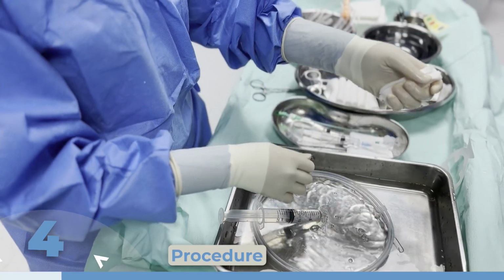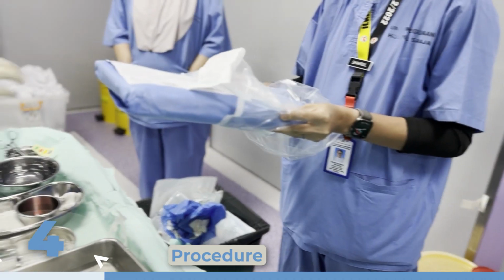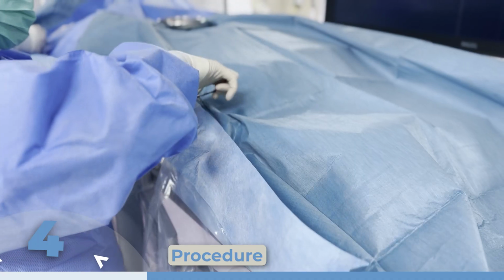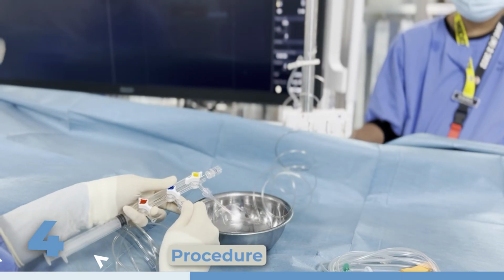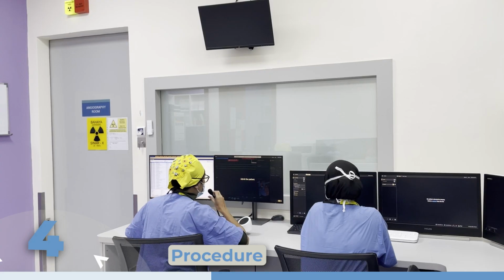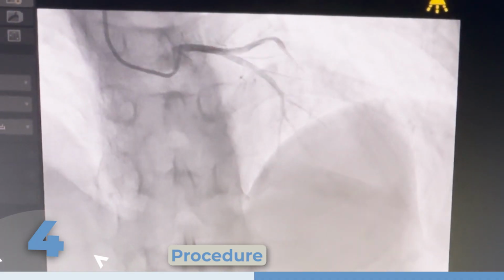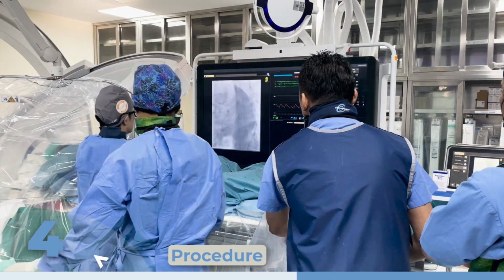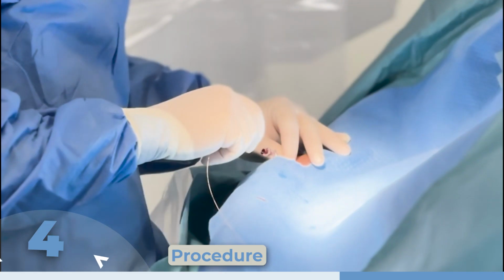Throughout the procedure, the cardiologists performing the angiogram are assisted by scrub nurses. These nurses provide support, hand them instruments, and help maintain a sterile environment. An assistant medical officer, stationed in the technician room, records all the details and events that occurred during the angiogram procedure. This documentation is essential for the patient's medical record and future reference.